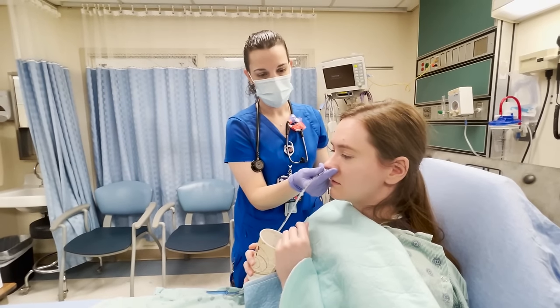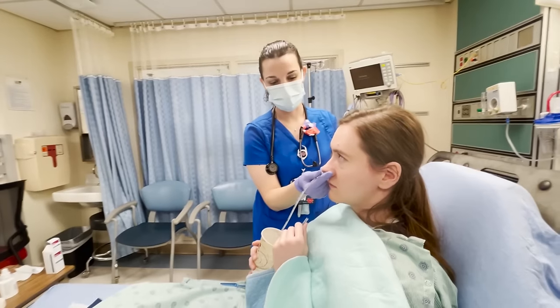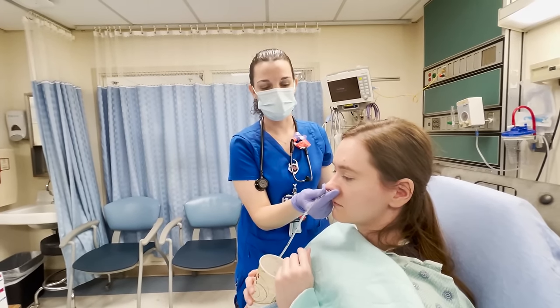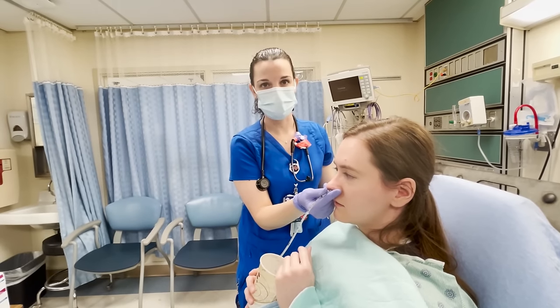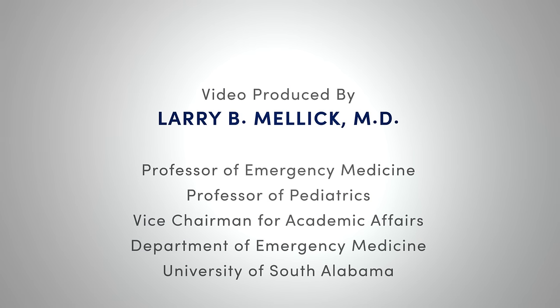The next step for a typical adult would be to go ahead and secure the tube. Before letting go, if you have a second set of hands, hold it in place while somebody verifies placement by auscultation.